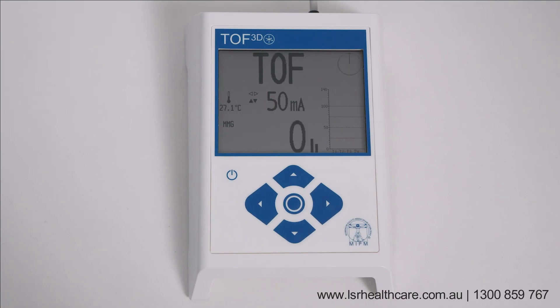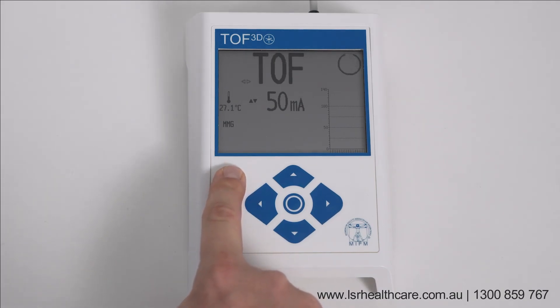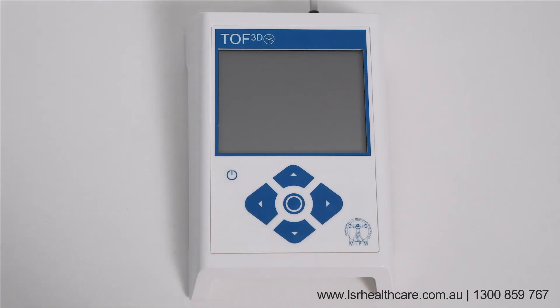It is safe to extubate your patient only if the TOF ratio was greater than or equal to 90%. Thank you for using an MIPM product and visit us at MIPM.com.